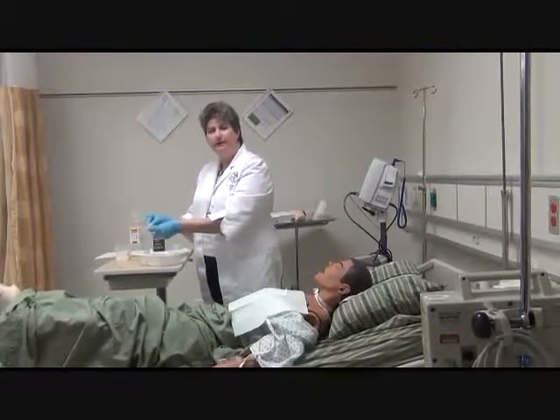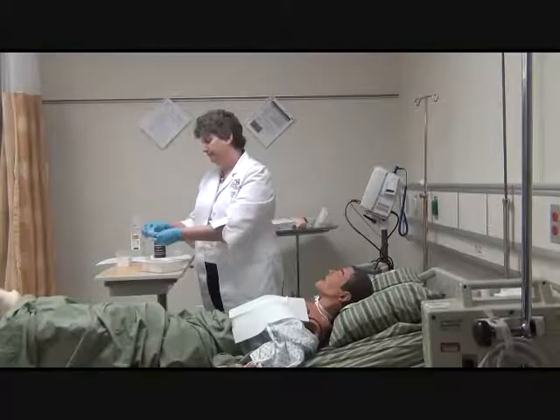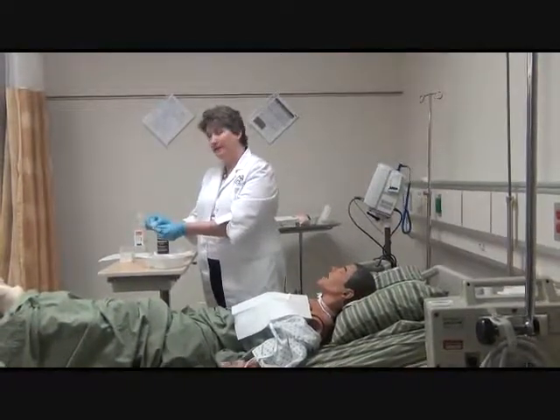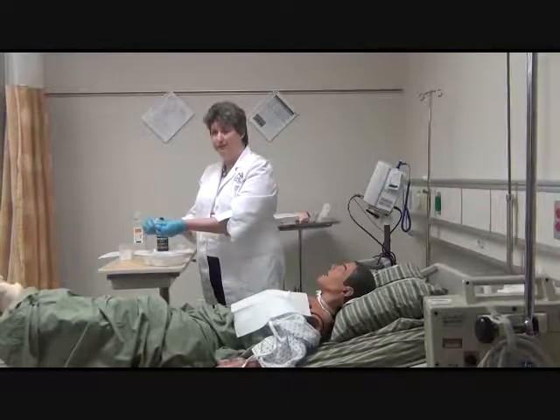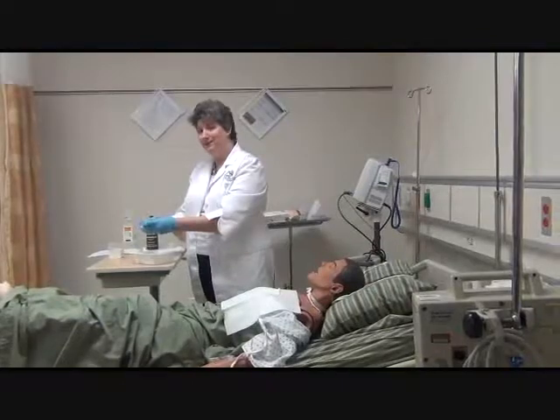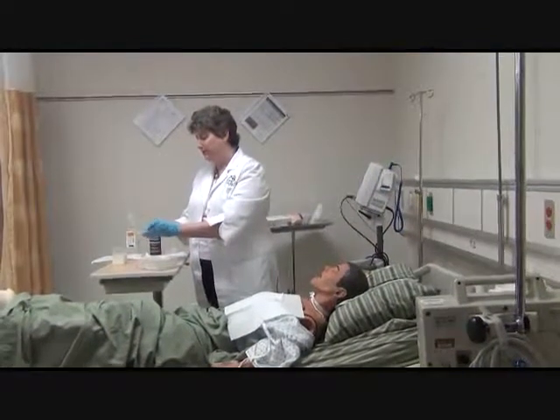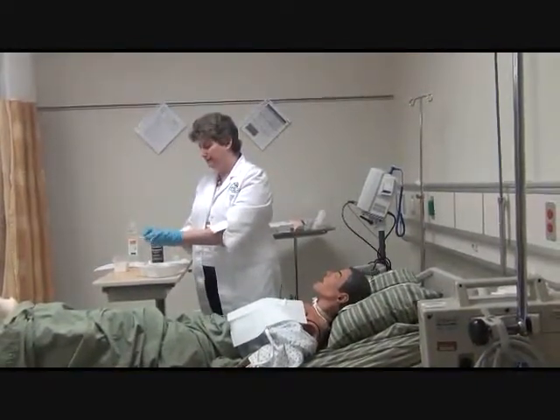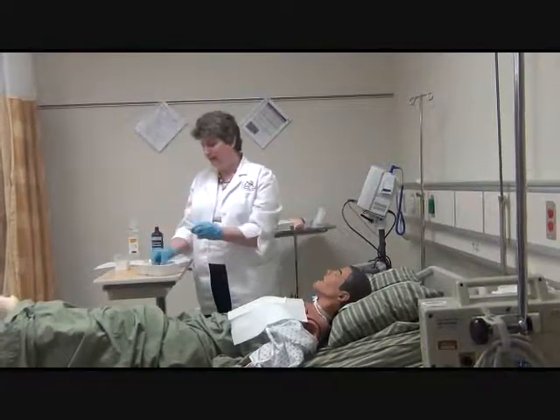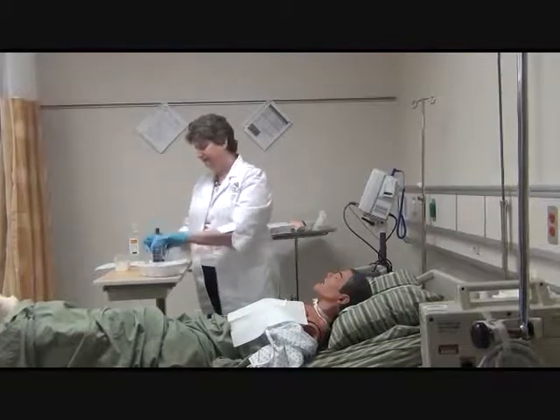Again, the reason it's nice to have on your goggles and your face mask is because at this point you really do get a lot of spray. And unless you're wearing a pair of glasses, you don't realize how much you're exposed to through this procedure, but it is a significant amount. Okay. At that point, when I have this cleaned up, I'm going to rinse it.